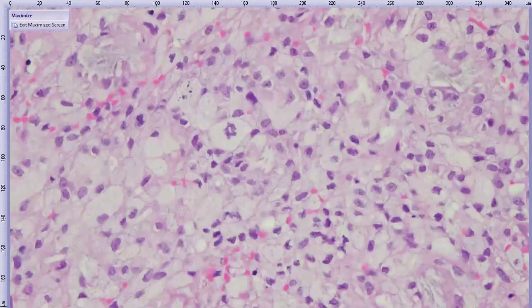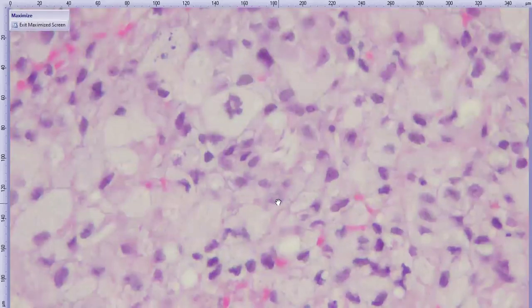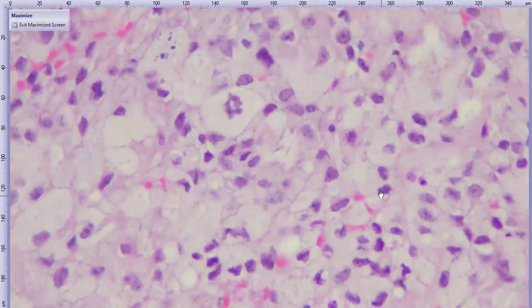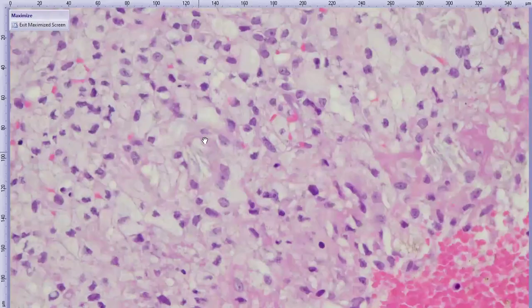So this corneal thickening is due to this very robust granulomatous inflammatory infiltrate. So all of these are macrophages. There are some multinucleated giant cells in here as well. And the reason it's so pale staining is because their cytoplasm is distended by all of these kind of teeny tiny, rather discrete vacuoles. So this is lipid. So we have lipid-laden macrophages. And in some areas, there is this kind of crystalline material that they're interspersed with. Sometimes it's within their cytoplasm.